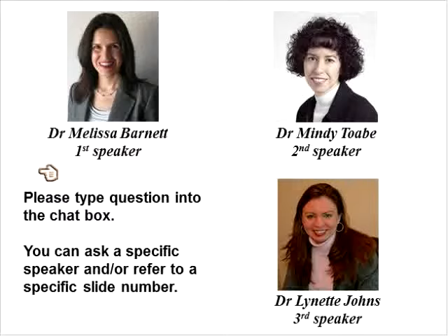I usually will prescribe ClearCare, and if the patient is having a problem with depositing, I will add a cleaner to the system as well. For example, I would use the Optimum Cleaner, and I would have the patient clean the lens first digitally, and then rinse it, and then put it in the ClearCare solution overnight. I wonder, does anybody just say, don't worry about manually cleaning your lenses, just put them in the case and watch it bubble?